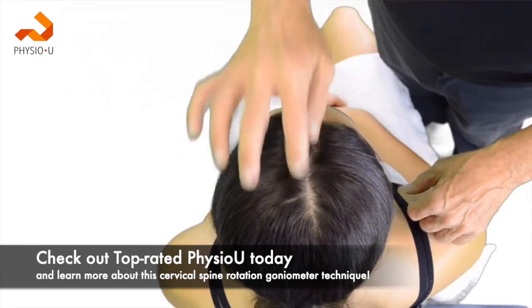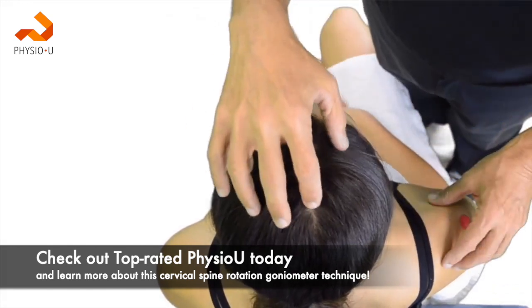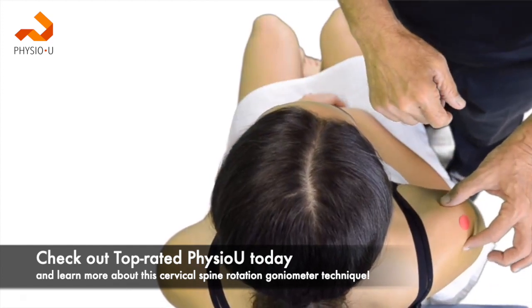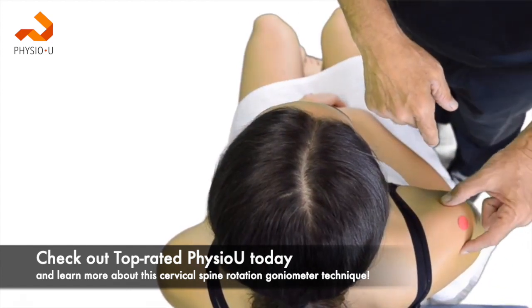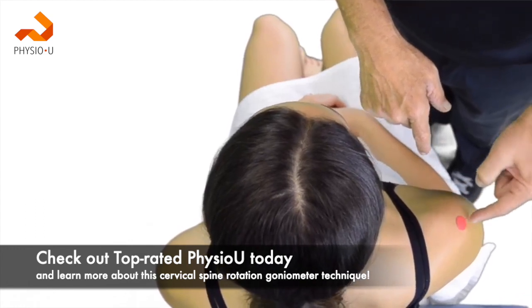Our moving arm would be through the axis, utilizing the nose, and our stationary arm will be the axis, coming out to the acromion process of the shoulder, palpating the posterior-anterior acromion, bisecting that over the lateral border of the acromion.